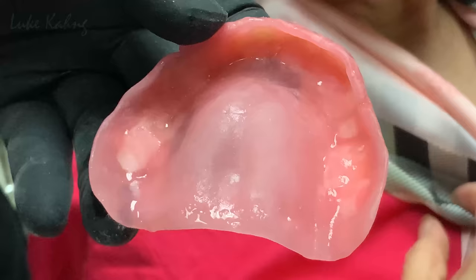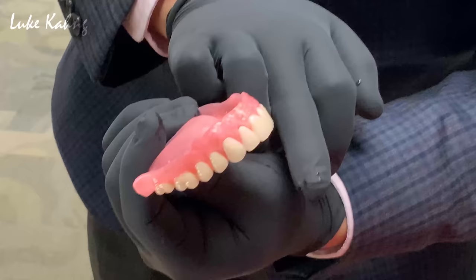Not only the facial problem, the lack of room, we have to make the metal mesh. So I need room. Okay? So that's why we're trying to do it. Dr. Emilio can put it into the patient's mouth. Look, from the outside. See that? It's adjusted there and adjusted there now. Okay? That's so fast. The inside was so thick.